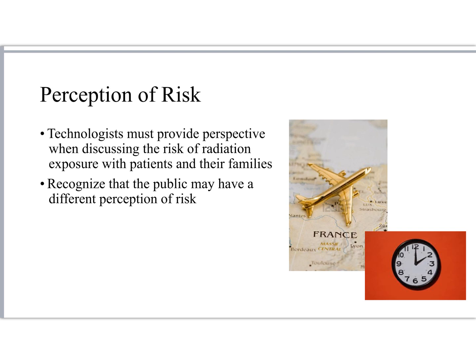And then I think it's helpful to think about time. This is yet another way to conceptualize risk. Natural background radiation is naturally occurring. It's all around us all the time, right? And our species has evolved in the presence of natural background radiation. So it's helpful to think about radiation exposure in terms of time, and we can compare that to radiation exposure for a CT exam.